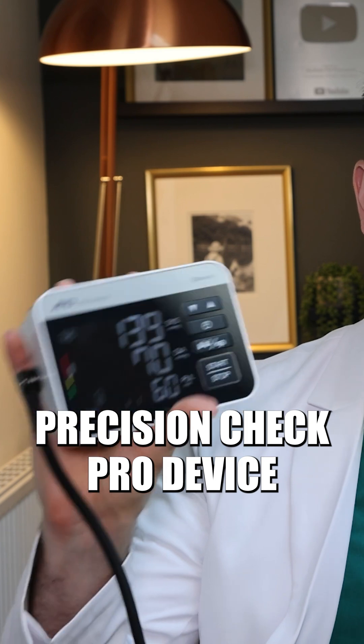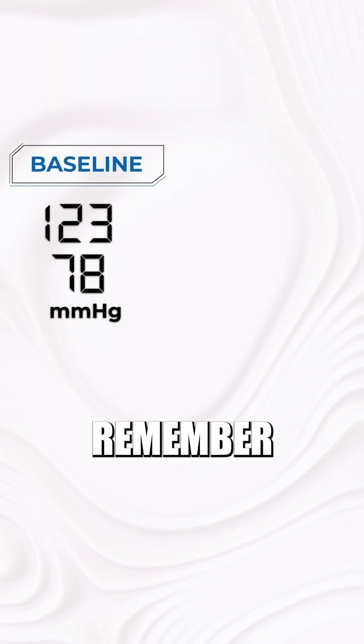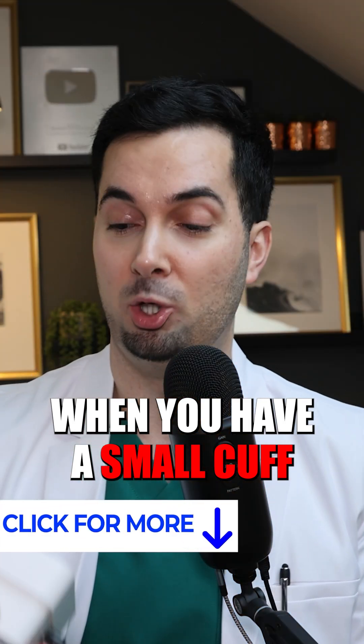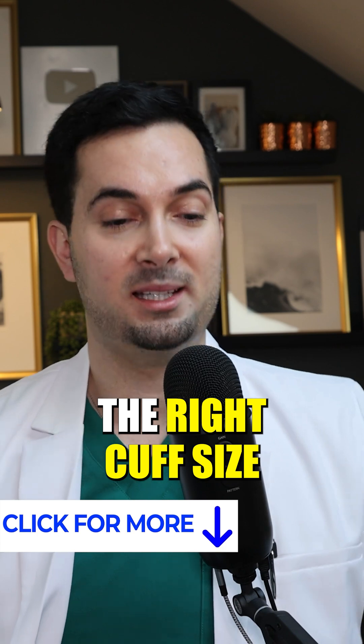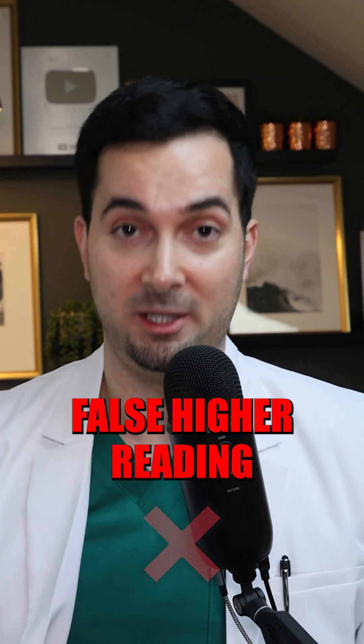The Monitor Precision Check Pro device — the AMD Medical one — has a cuff size detection warning. My baseline was 123 over 78. The blood pressure went up to 139 over 70 when using a small cuff. You need to have the right cuff size. As you can see, it's massively increased the blood pressure, giving us a false higher reading.